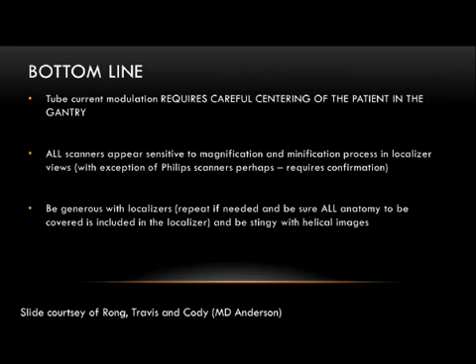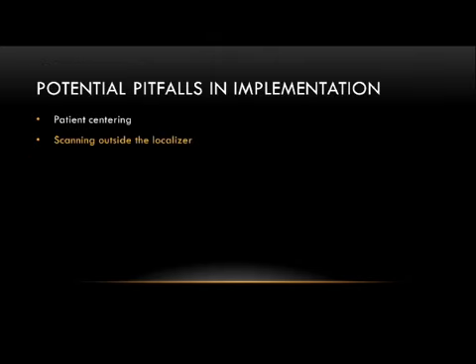But definitely something to keep in mind, and something to ask everyone at your practice is, okay, you're doing a chest, abdomen, and pelvis, where are you centering? And to make sure it's consistent. Have a practice, have a plan throughout your institution.